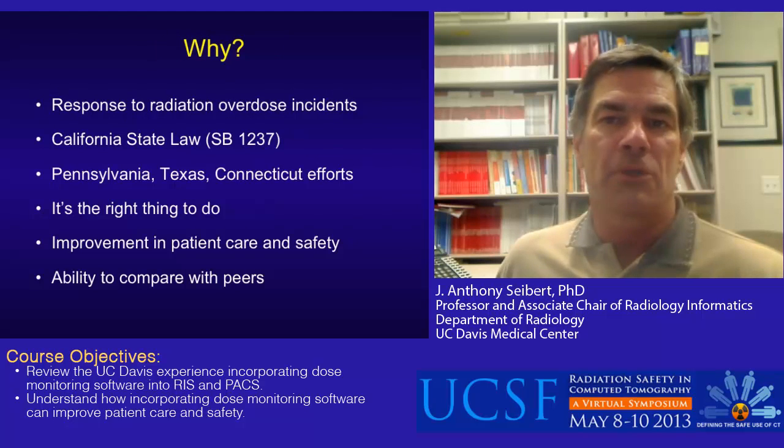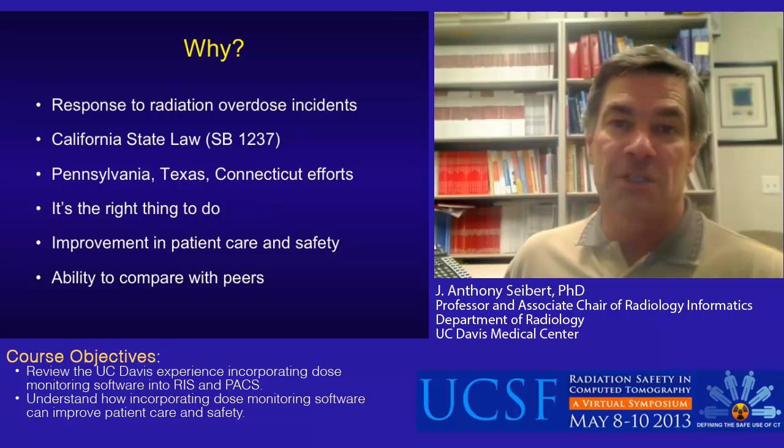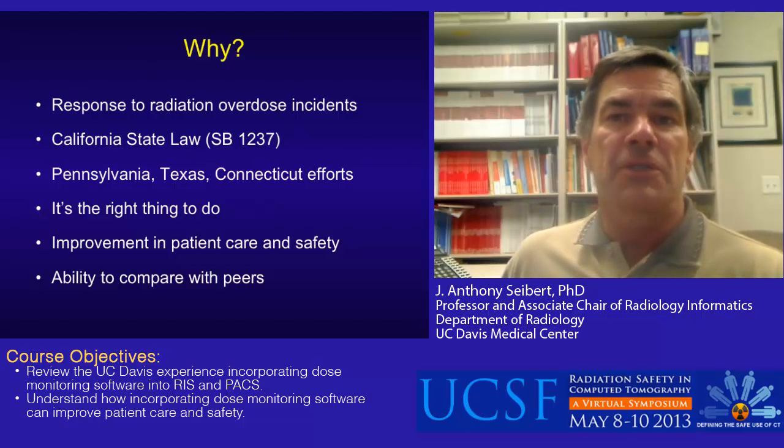Why incorporate dose monitoring software? CT overdose events that were big news in 2008 through 2010 garnered the attention of legislators. This resulted in the implementation of SB 1237 and a law signed in the state of California requiring dose metrics be placed in the interpretive report.